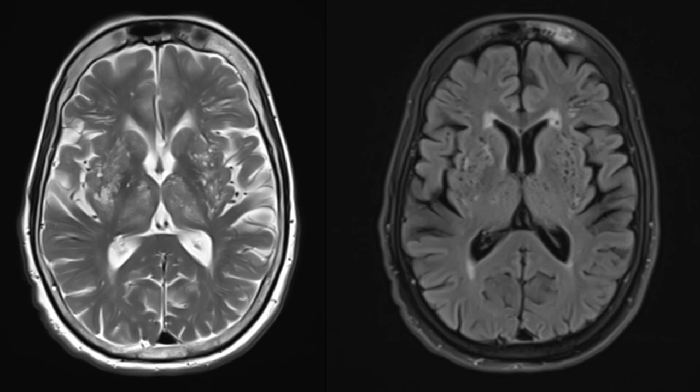Images of a 75-year-old patient show multiple perivascular spaces in bilateral basal ganglia and thalami, which are completely suppressing on FLAIR. These are called état criblé or status cribrosus, and the appearance is also described as Swiss cheese. Multiple linear perivascular spaces are also seen in bilateral white matter.